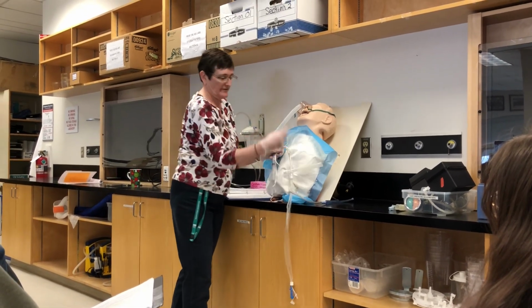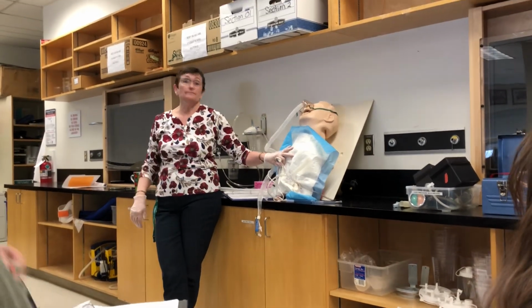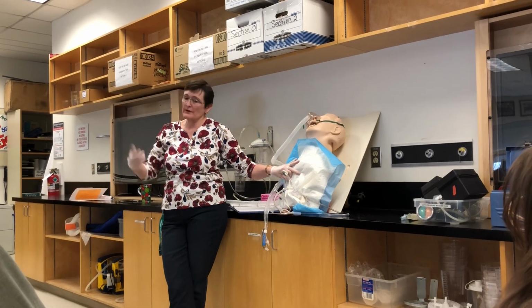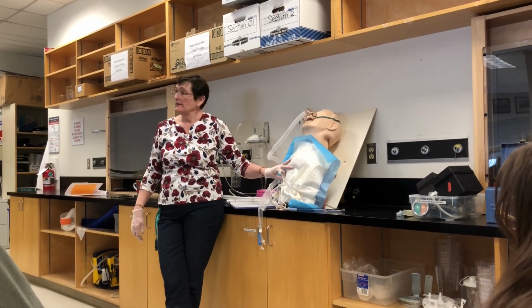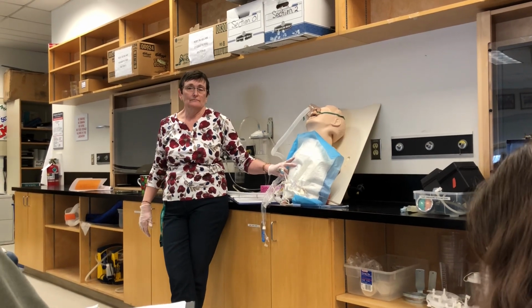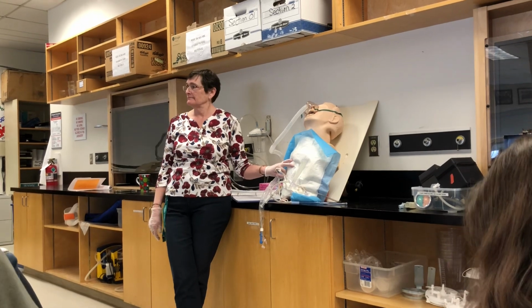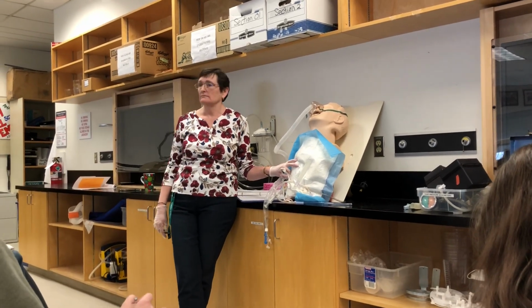That would be on at about 15 liters per minute. Okay, so he's on 45% oxygen, extubated at peak inspiration on the third breath. I'm going to sit and watch him. Okay, Mr. Smith, can you talk to me? I want him to talk.